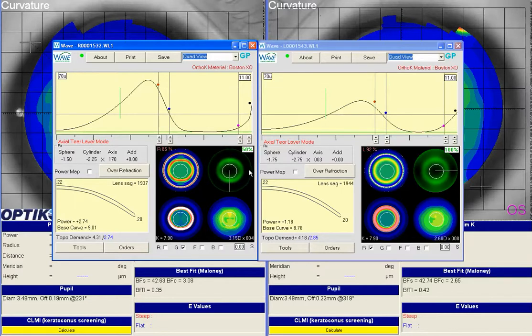So vertically, compared to horizontally, we have about a diopter and a half more demand or power, and that should hopefully mold out some of the cylinder. I am going to just spin through the different meridians to make sure the tear graph looks fairly stable, and it does.